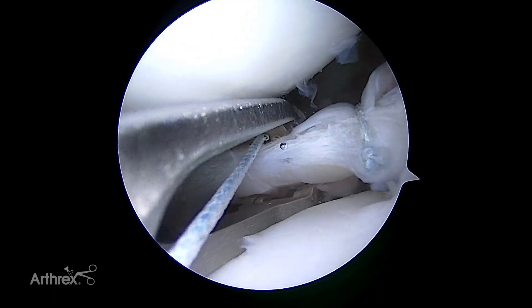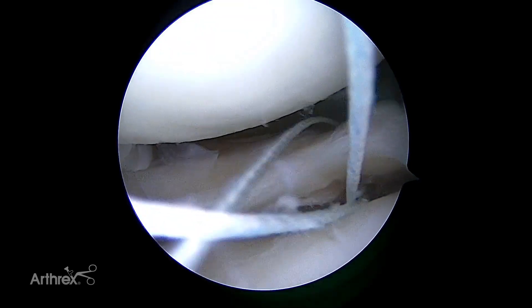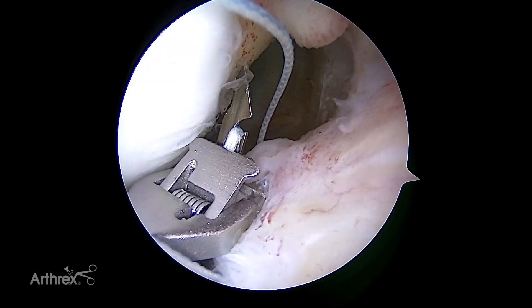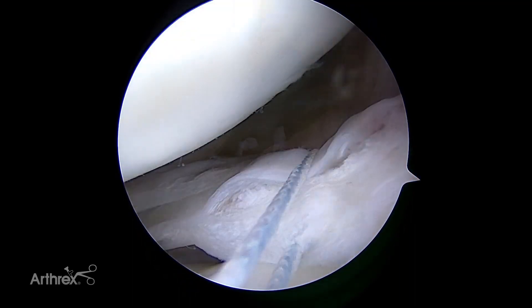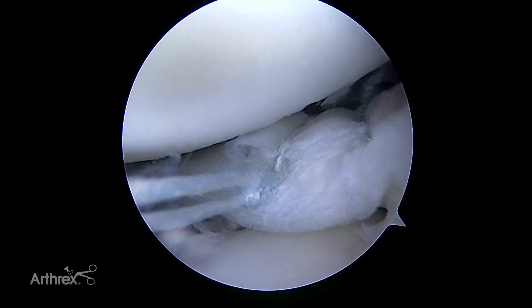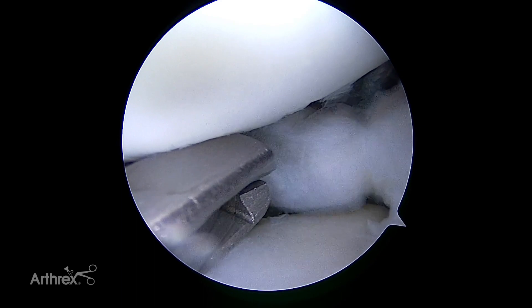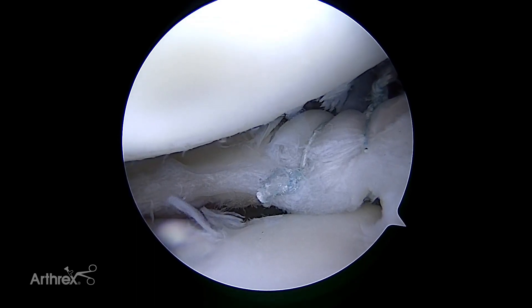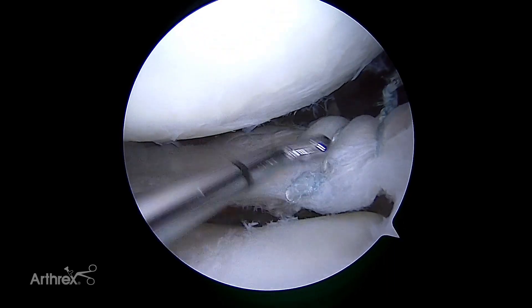Each suture is passed and tied prior to proceeding with another suture. After passage of sufficient sutures, the meniscus is assessed for repair stability and knot security. This meniscus was repaired with three sutures. Two were placed with the knot above the meniscus. The most anterior suture was placed in an inverted fashion such that the knot is below the meniscus, which may be possible in some knees if the compartment is not tight.